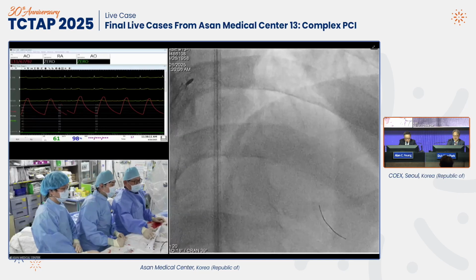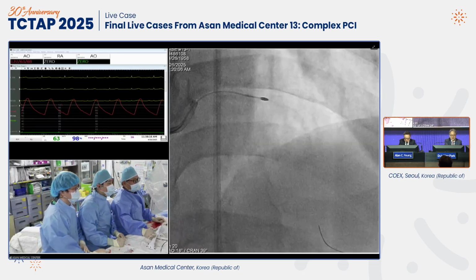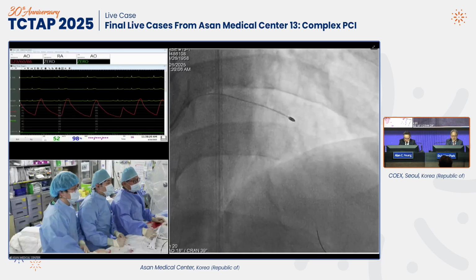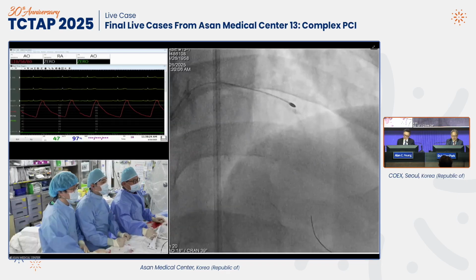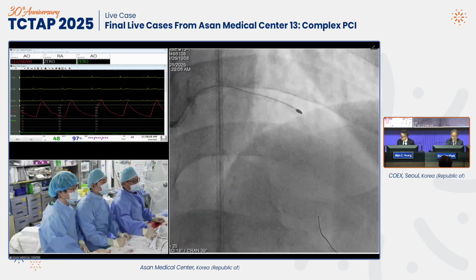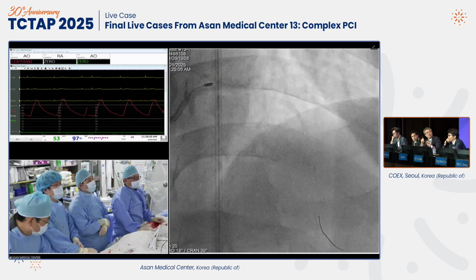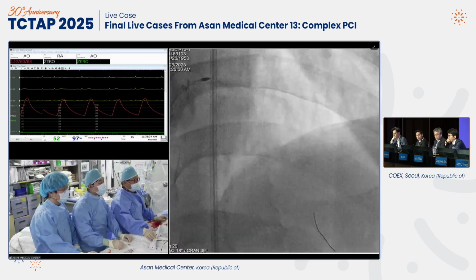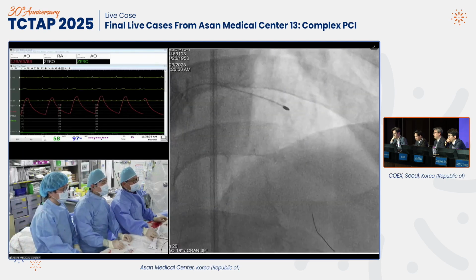And let's see. What RPM are you doing this at? RPM is more than 180. 180? Doesn't sound like 180. Maybe we can ask the panel what the usual speed is when you start the rotablation? This is 180, more than 180.